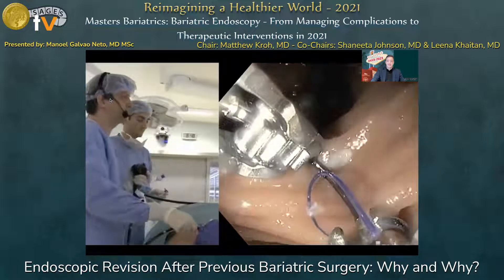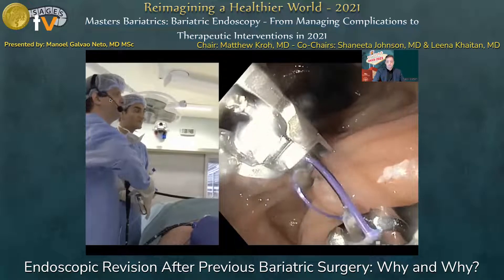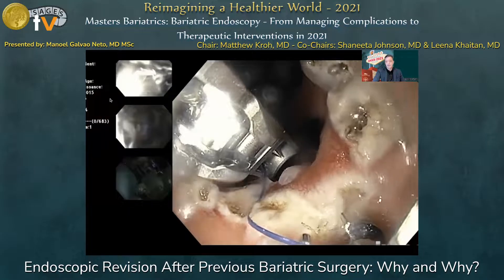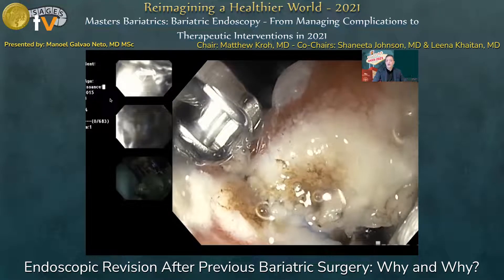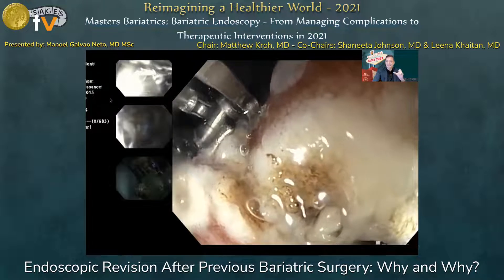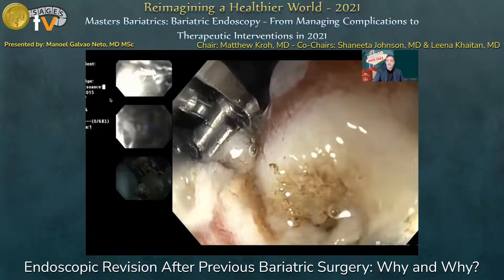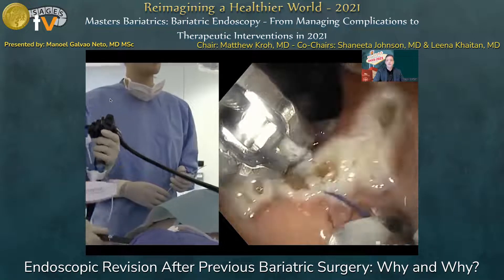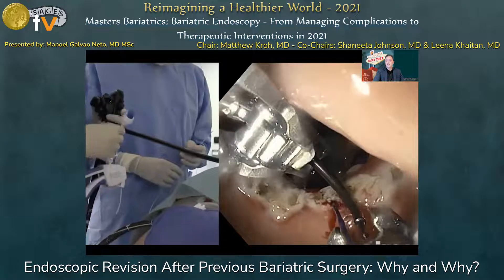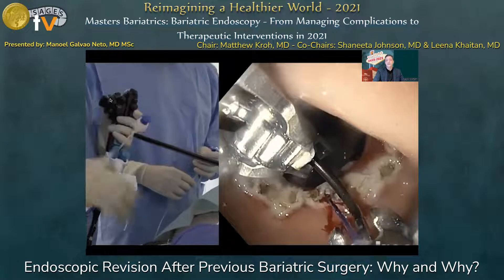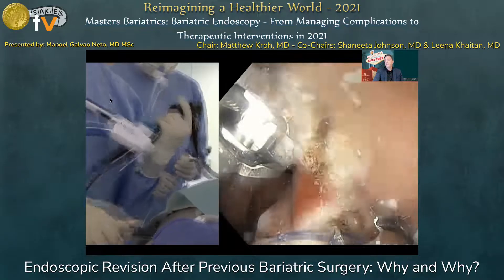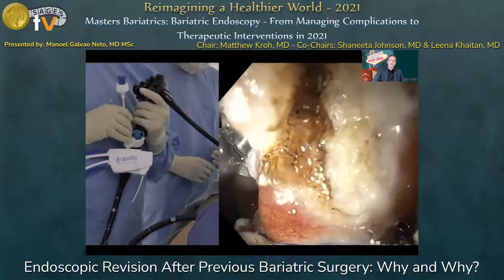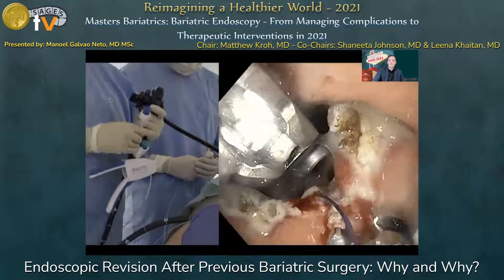You can see here the way we perform the suturing. We get inside the gastrojejunal anastomosis. In this case, there is some bleeding because of APC. We use a surgical needle and suture, passing from one side to the other, building a full-thickness suture. The question is how much we can remodel and reduce the anastomosis — you are about to see that on the following images.